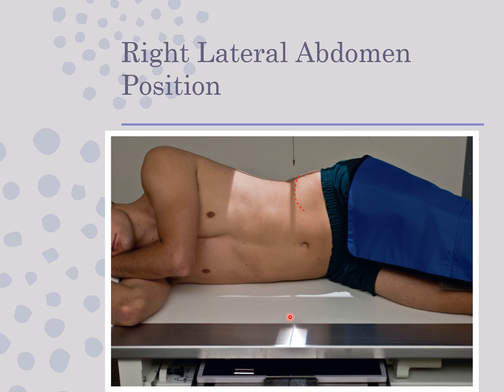So the book likes to show you these perfect small stenic patients, and even though the radiologists want diaphragm on a supine abdomen, the book and the registry say we don't need it. So that's why some people definitely would fit on one IR placed portrait.